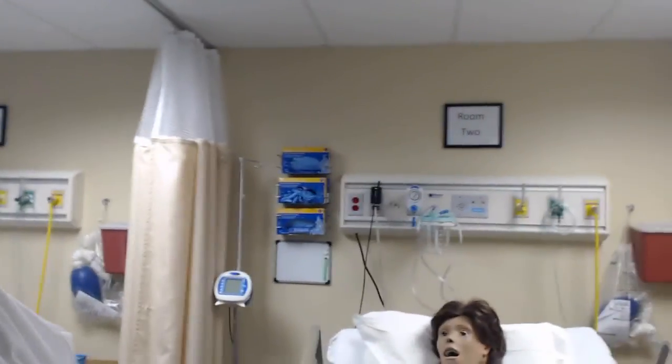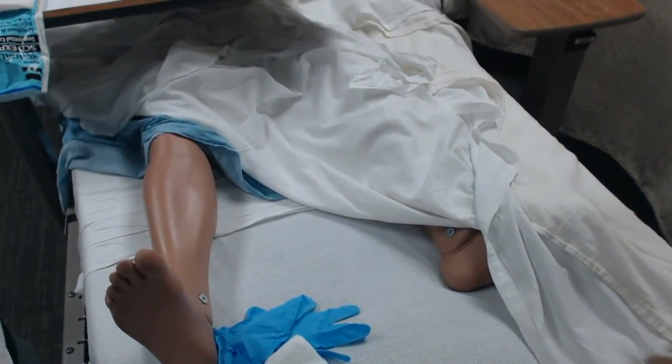And we'll talk about that in a second. So I said we were going to talk about how to size the patient. So what I'm going to do is put the camera down on our patient's leg here, so you can see her leg.